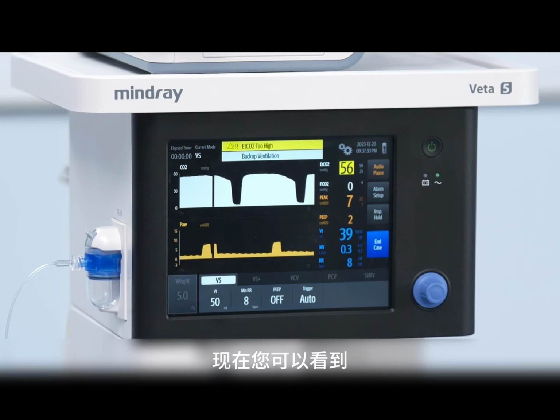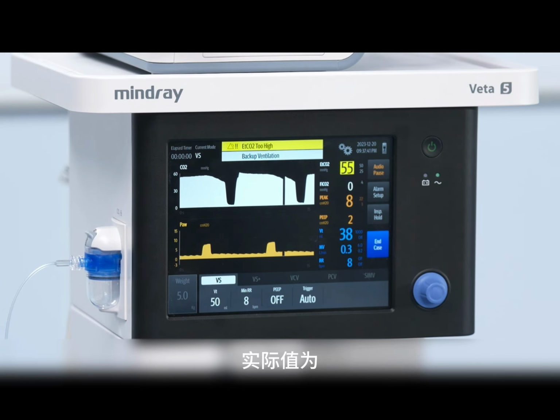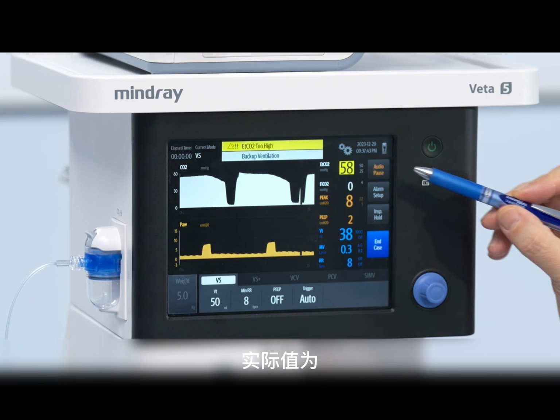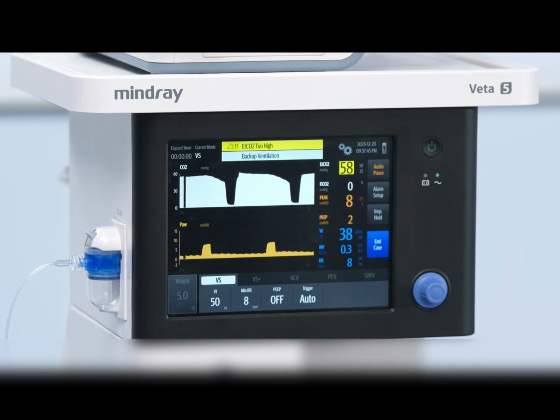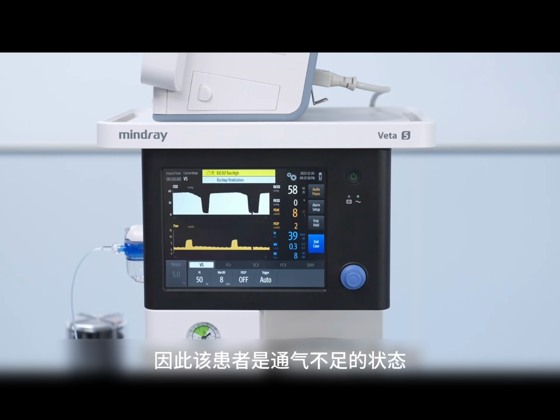Right now you can see a yellow warning message on the top indicating that the end-tidal CO2 value is too high. The actual value is 58, but the reference range for end-tidal CO2 of dogs is between 35 to 45 mm of mercury. Hence, this patient is hypoventilating. Be careful and think before you act.